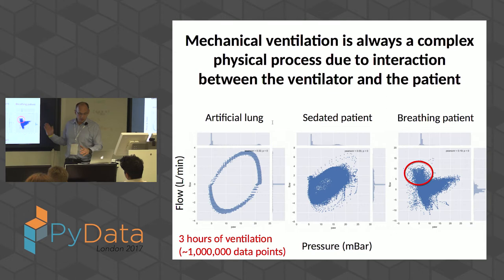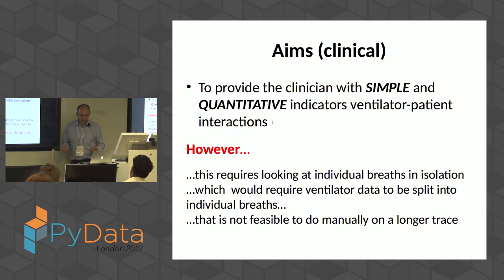So the key aim from my perspective, in the longer term, is to provide the clinician with simple and quantitative indices of ventilator-patient interactions. Simple because ventilation is only one part of our job and the clinician has very little time to analyze complex patterns, so it needs to be something easily quantifiable. However, to develop something like that, we need to look at individual breaths in isolation.